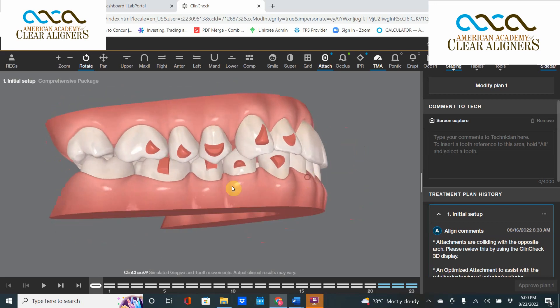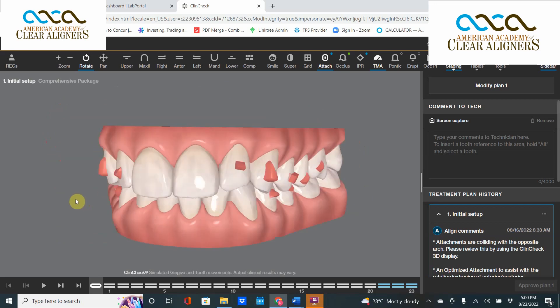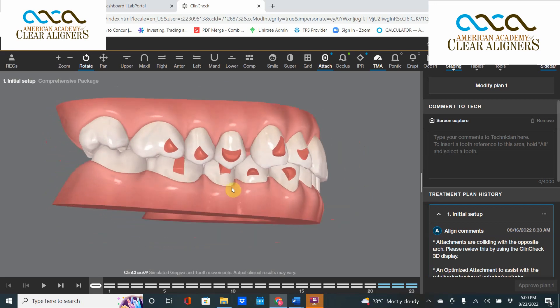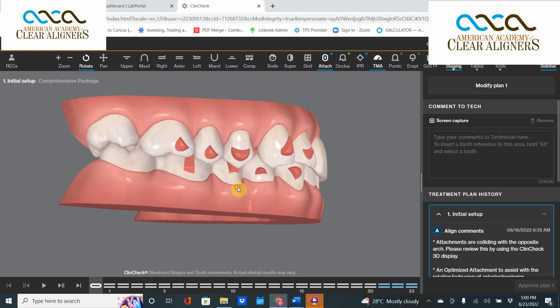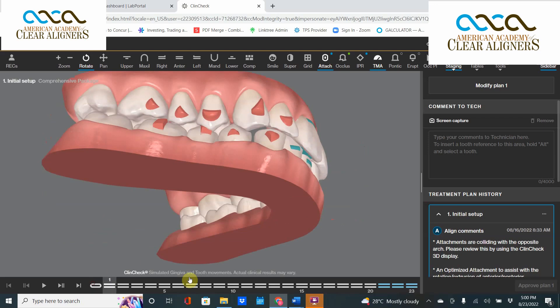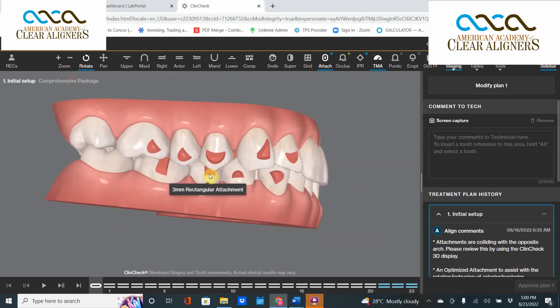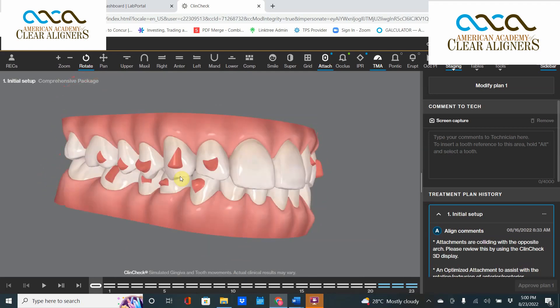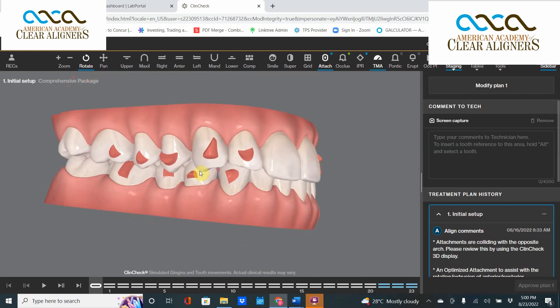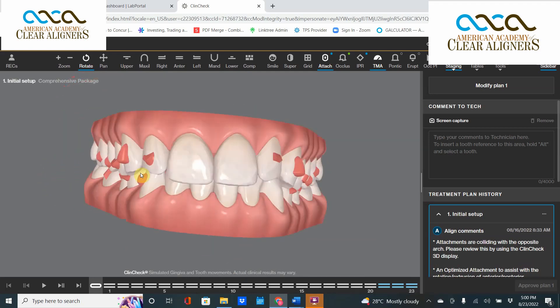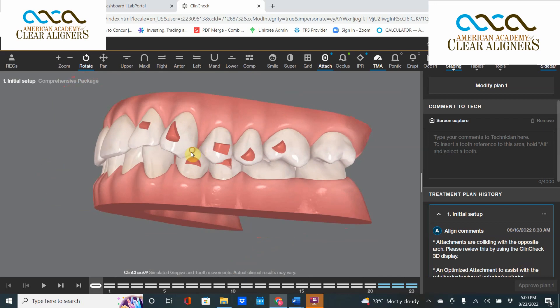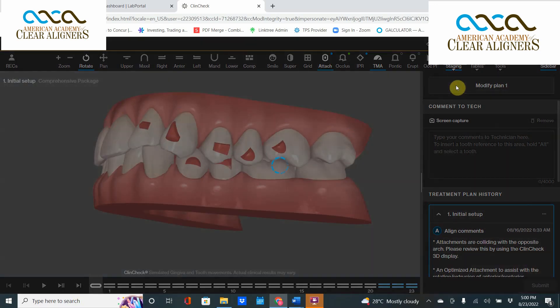Take a look right here — this is a deep bite case with a little bit of posterior bite collapse. What I want to focus on is this attachment colliding right in there. That attachment is getting smashed, and you cannot proceed with a case where the attachment is hitting the opposing arch. It will create unwanted forces and will probably just break off as soon as the patient bites down.